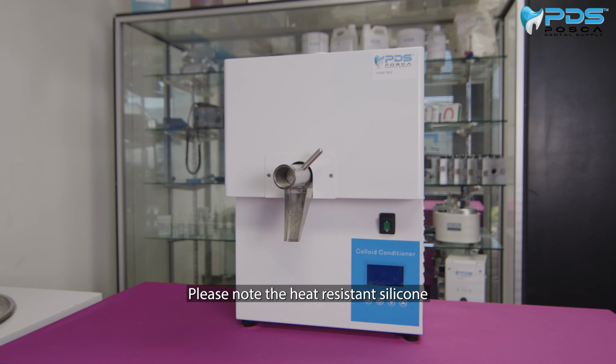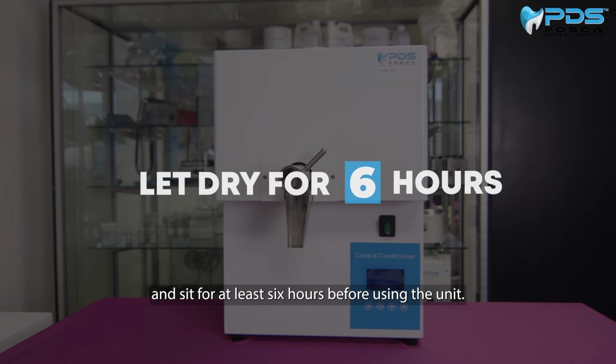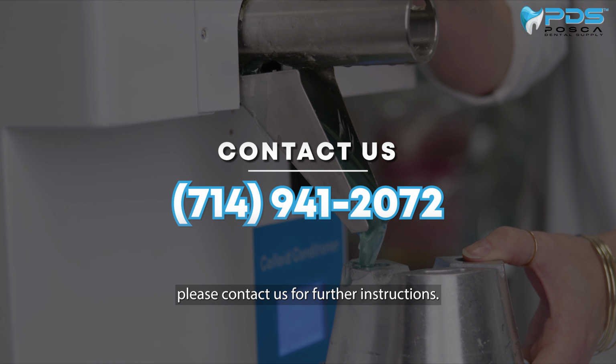Please note the heat-resistant silicone will need to dry and sit for at least 6 hours before using the unit. If you have any questions or concerns, please contact us for further instructions.